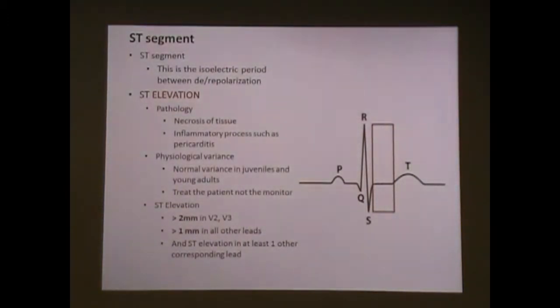If the clinical picture is pointing to that this is a STEMI or acute coronary syndrome, and it is just 1 millimeter, I'd rather have you talk to the doc and say, hey, this is what I've got, this is how he's presenting, and so forth. And then if we activate the cath lab, personally as a cath lab member, I don't care. I'm going to come in, and if they turn me around midway, they turn me around. It's not a big deal. But remember that it needs to be in concurrent leads.